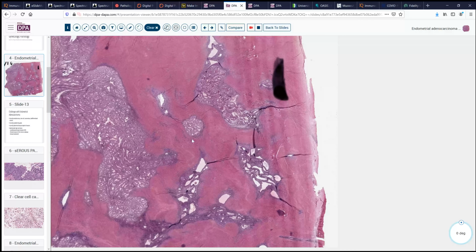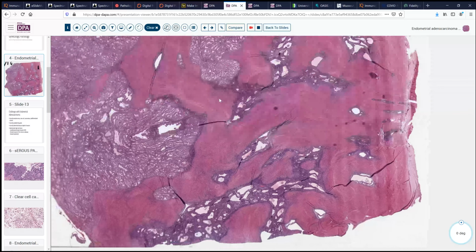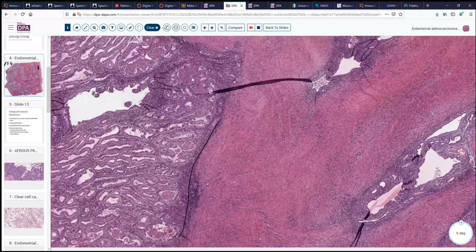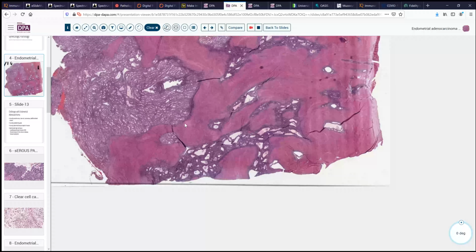in this patient. But in fact, we have no single cells, we have no desmoplastic reaction to this tumor, and in every instance where we look, we can see a band of endometrial type stroma surrounding these glands if there are no glands there. So this is all indicative of endometrial adenocarcinoma with squamous metaplasia that is still essentially in situ because it has extended down adenomyosis, partially involving it.